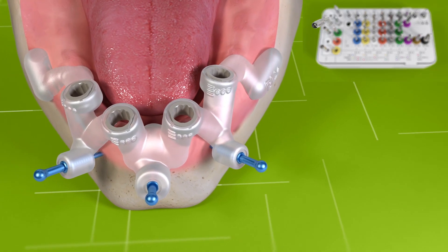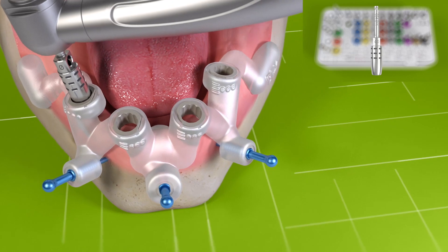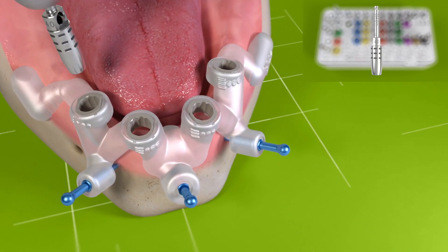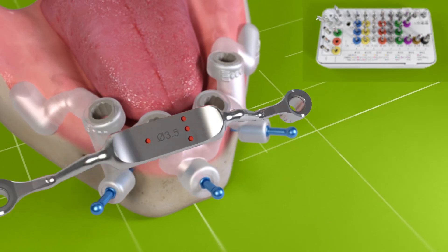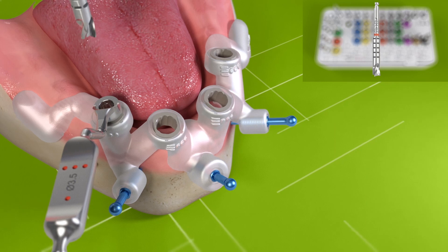For flapless surgery, use a mucosa punch to remove soft tissue. Flatten the bone ridge with a milling cutter.